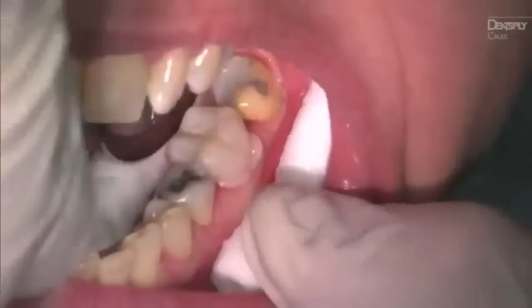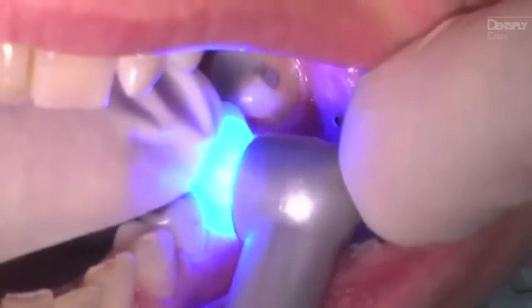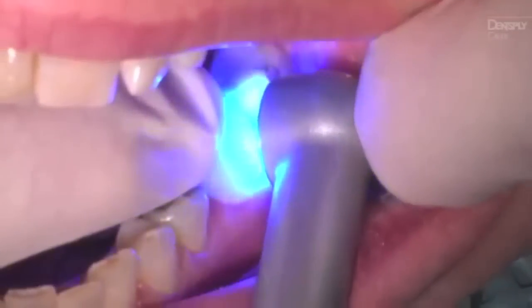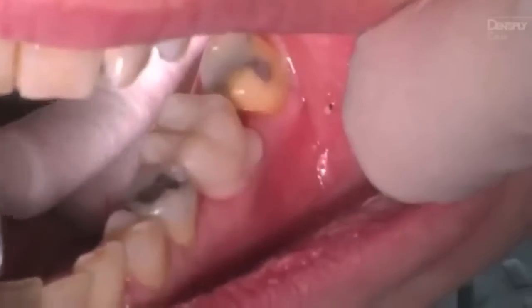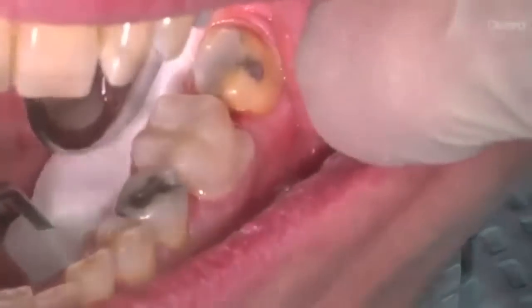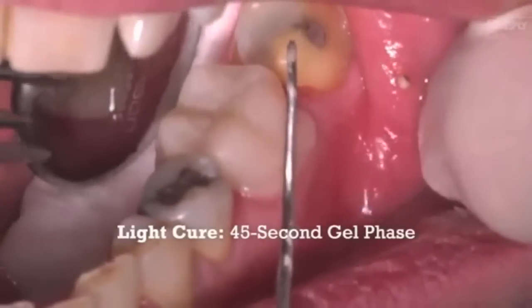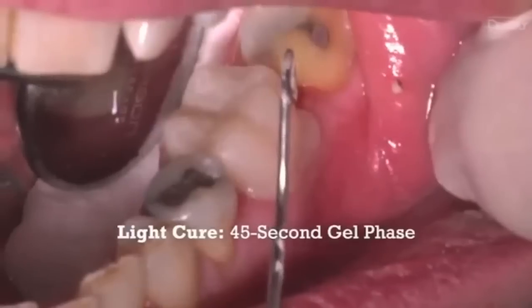After the restoration is seated, it's time to remove marginal excess. For light cure cleanup, cure the excess cement at the margins within the first minute following intraoral insertion. Rotate the curing light tip for no more than 5 seconds per buccal and lingual surfaces. Excess cement will then reach a gelled state, remaining in that gelled state for approximately 45 seconds.